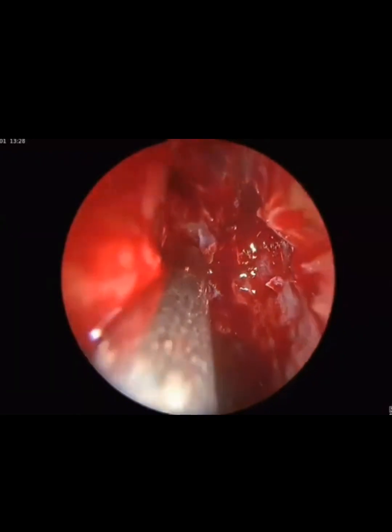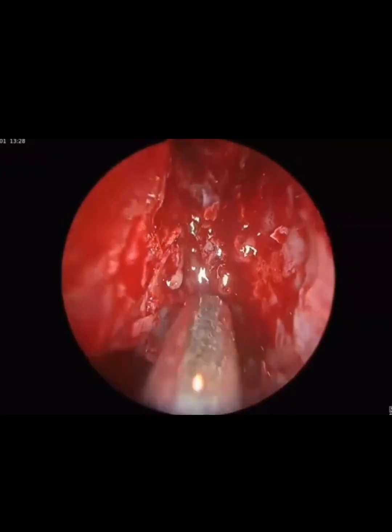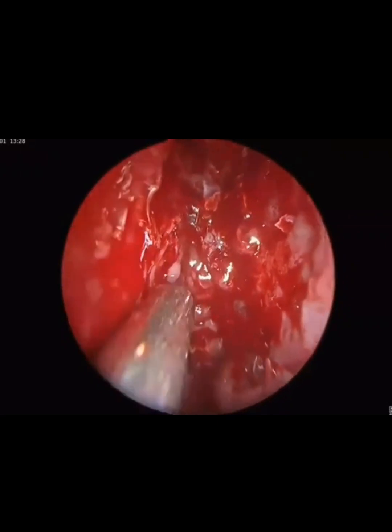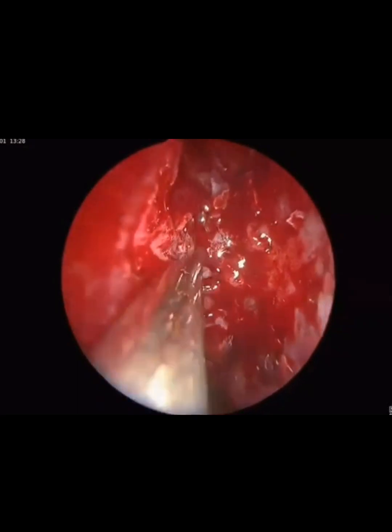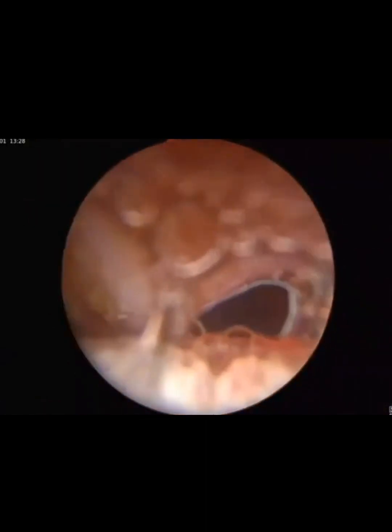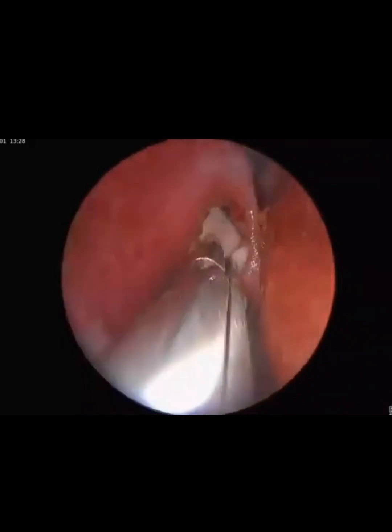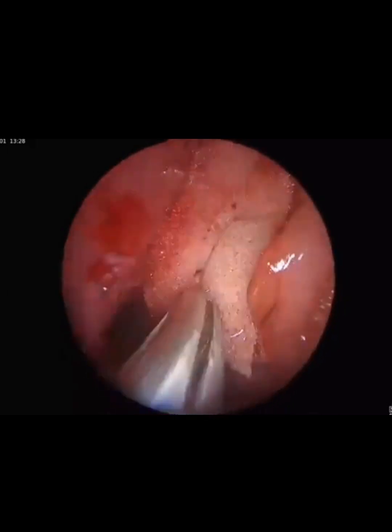See, this is the lamina, okay. I have cleared the anterior ethmoidal area. Here is not the danger area. What is the danger area? If you pierce the lamina of the posterior ethmoid, then the medial rectus is directly there. So be careful while piercing the lamina over the posterior ethmoid, because there is very little periorbital fat at the posterior ethmoid. So be careful.